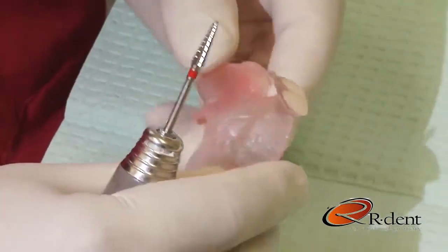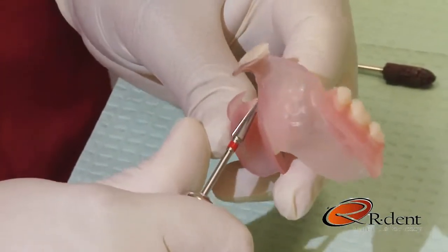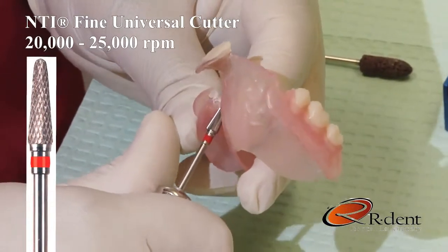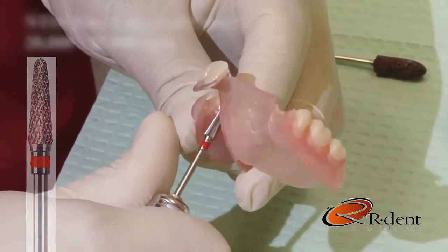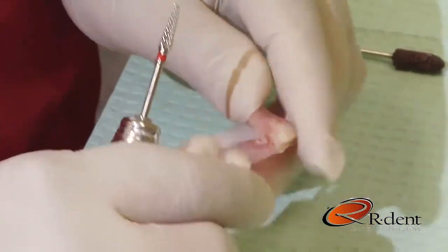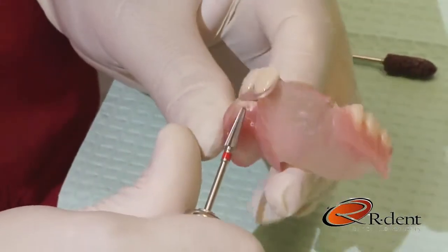When reducing the retention by relieving the mesial and distal undercuts of abutment teeth, I like to use the fine NTI universal cutter at approximately 20 to 25,000 RPMs. When using this cutter, remove a little material at a time to assure not over-relieving the partial.